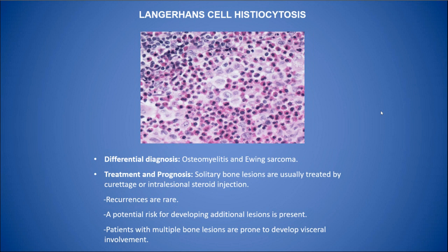And I also probably will include here a very rare disease that can affect bone and soft tissue, which is Rosai-Dorfman disease, where the histiocytes will be positive for S100 and negative for CD1a and Langerin, and they will show a phenomenon of lymphophagocytosis, also referred to as emperipolesis. They usually have this background reactive inflammatory infiltrate with lymphocytes, plasma cells, and eosinophils. But the histiocytes are larger, pale, and they show lymphophagocytosis. And again, positive for S100, negative for CD1a and Langerin.